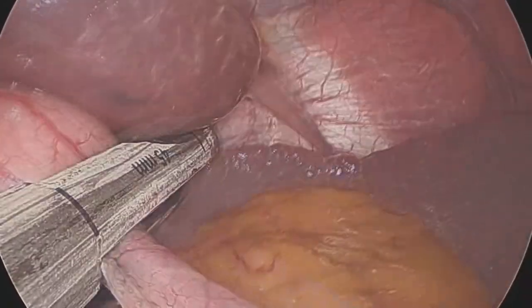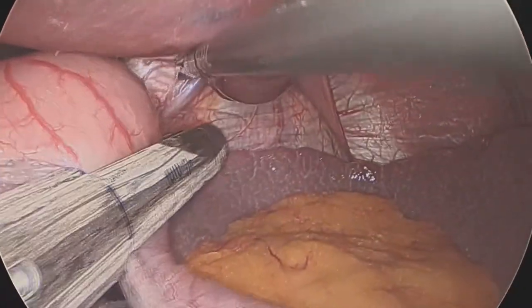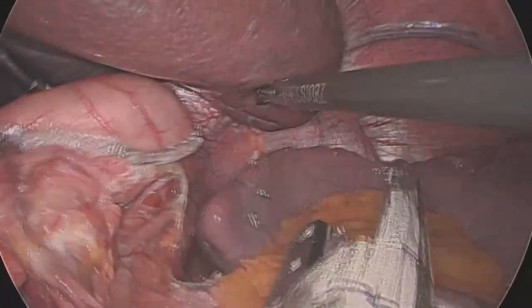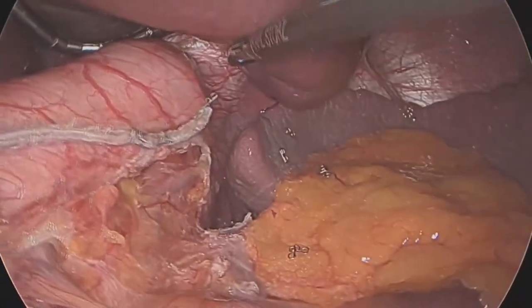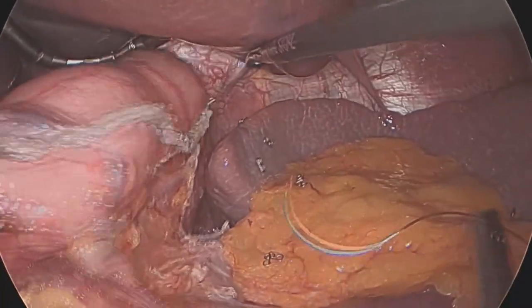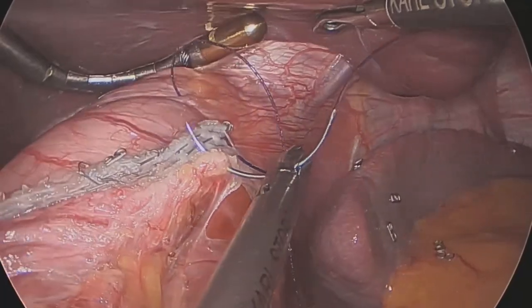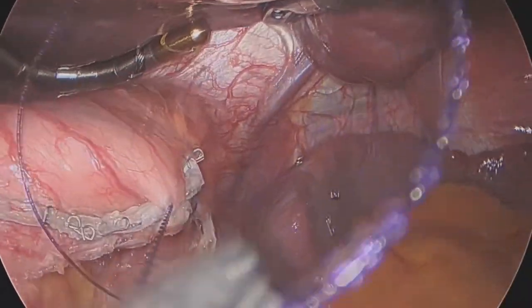In this case, fortunately, there is no severe fibrosis over the sleeve, but in some cases there is a very severe inflammatory reaction, maybe due to a staple line leak. So cleaning up the fibrosis is also very important for further weight loss, and the patient sometimes feels fullness.